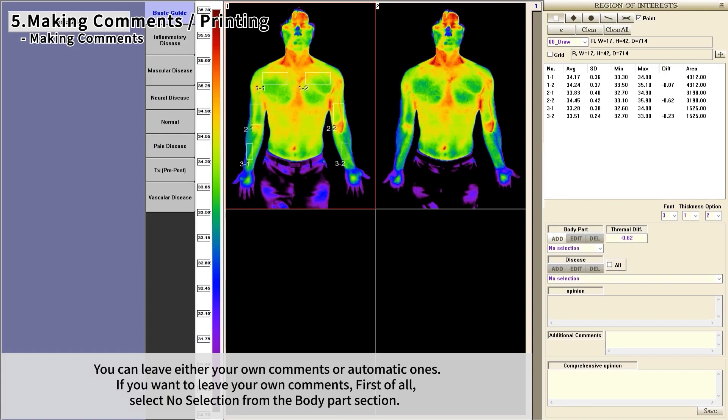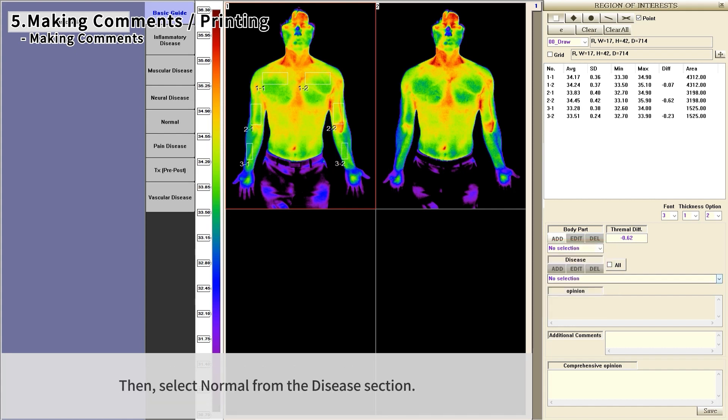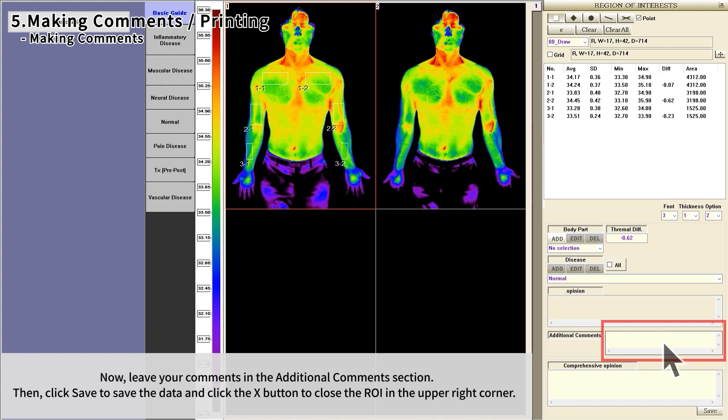You can leave either your own comments or automatic ones. To leave your own comments, select No Selection from the body part section, then select Normal from the disease section. Leave your comments in the additional comments section, click Save to save the data, and click the X button to close the ROI window in the upper right corner.